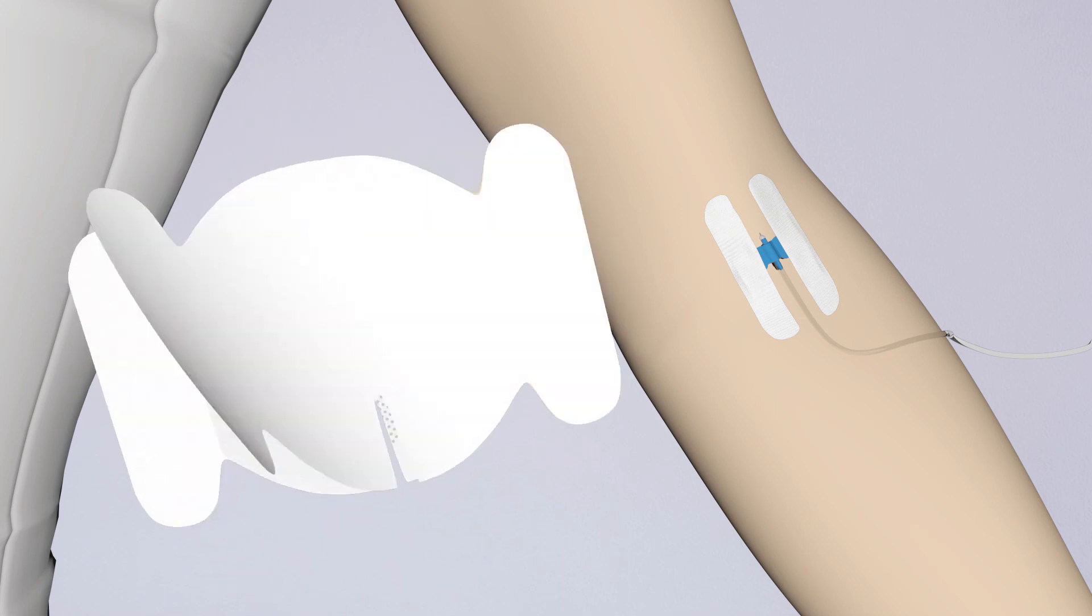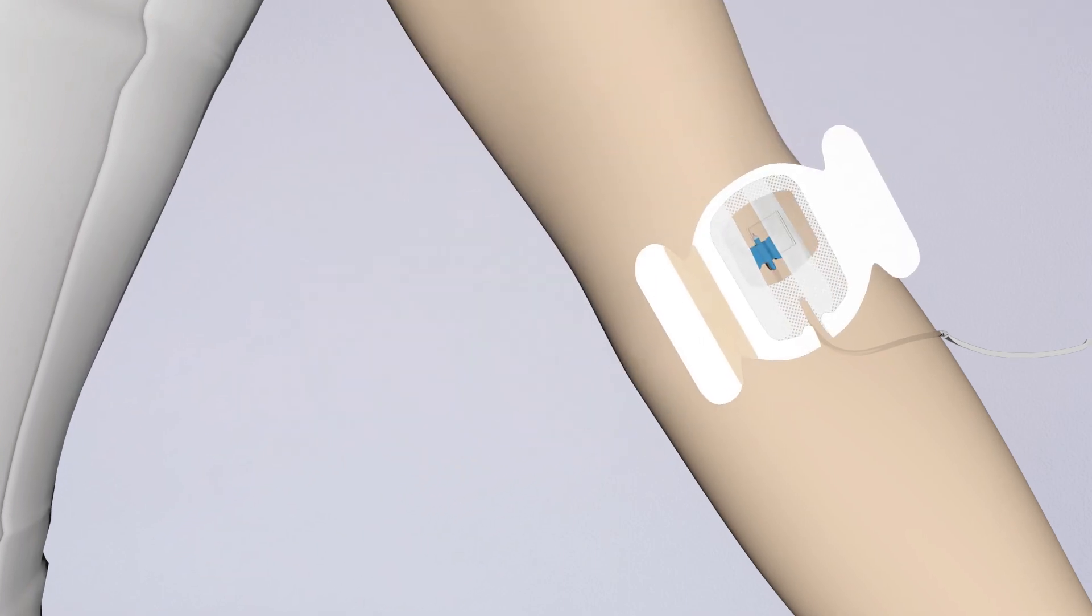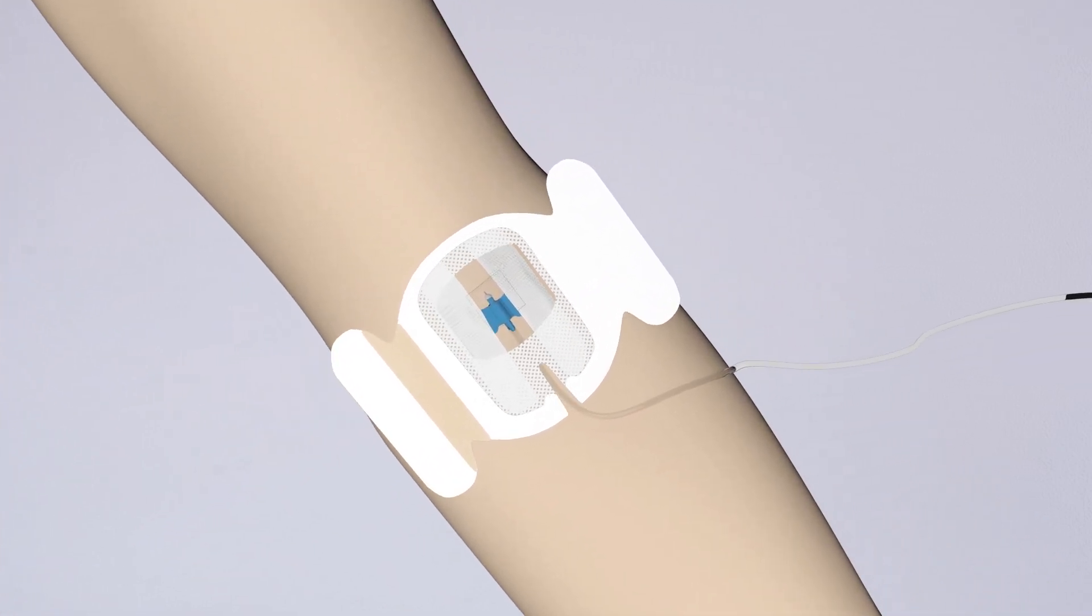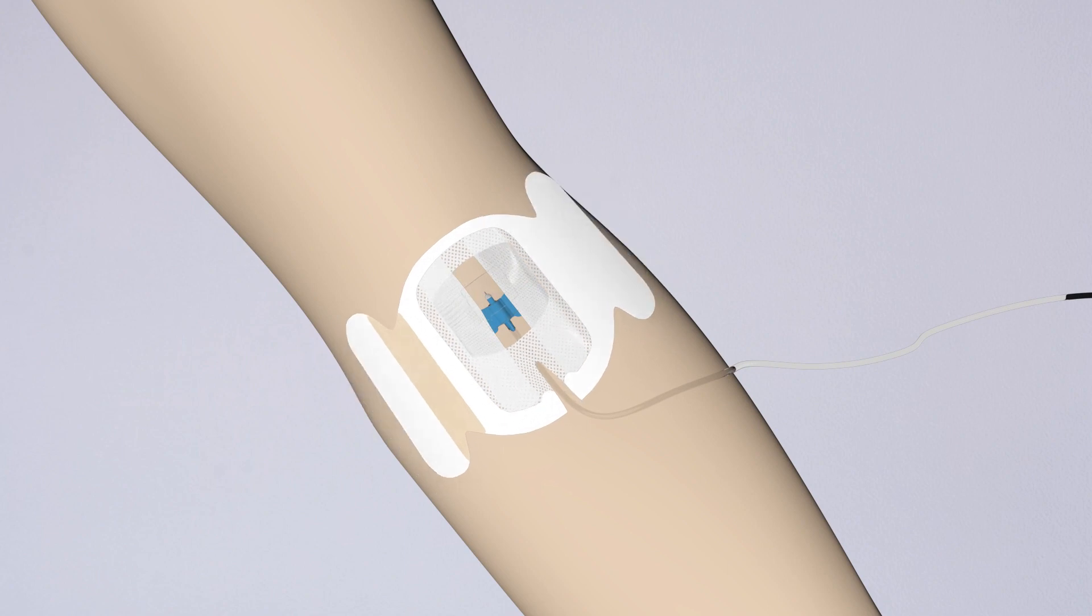3. Peel off the release liner. 4. Centre the gel pad of the dressing over the insertion site and press gently. Do not stretch the dressing during application, as tension can cause skin trauma.